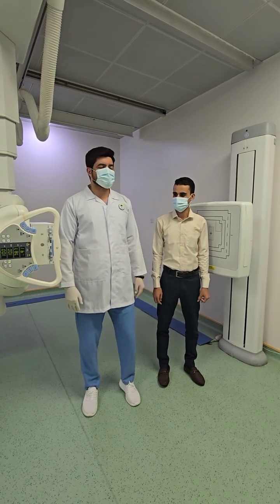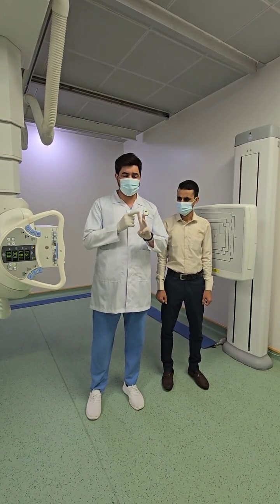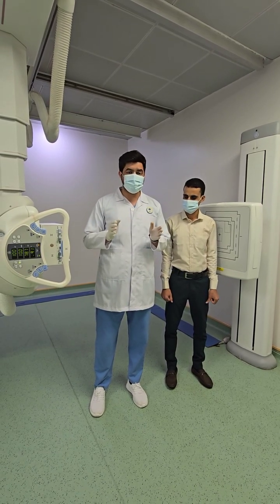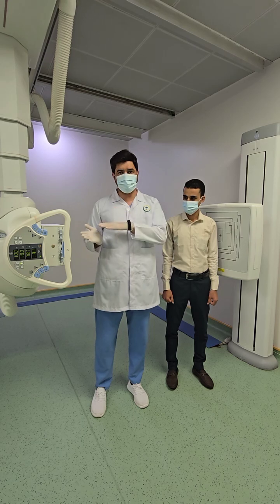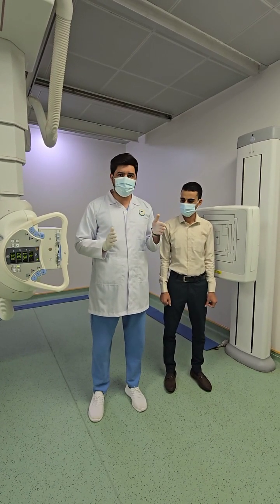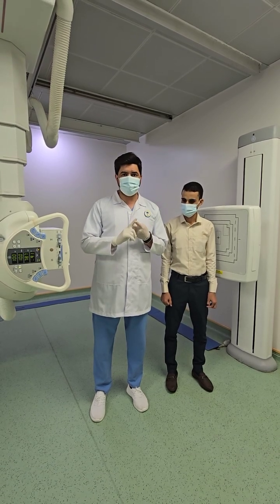Okay. Actually, there are three ways in which we can position a body. One is the erect position, one is the lying, and the other is halfway between the erect and the lying position. The lying position is called the decubitus position, and the erect has two further positions. One is standing, the other is sitting.